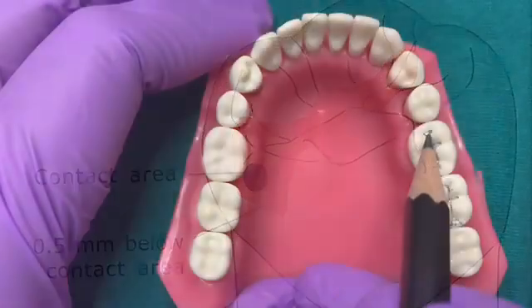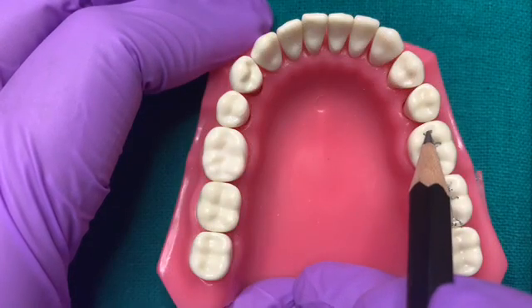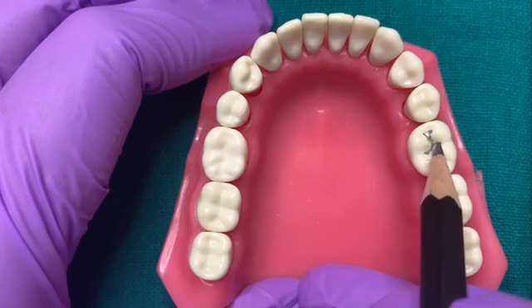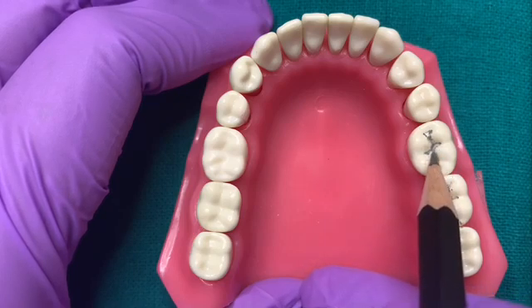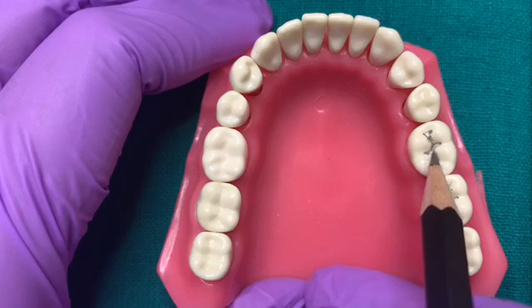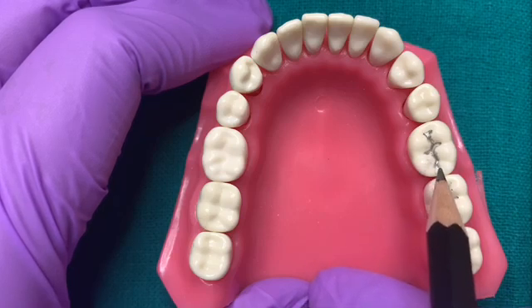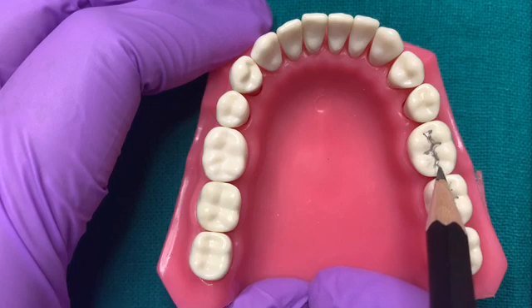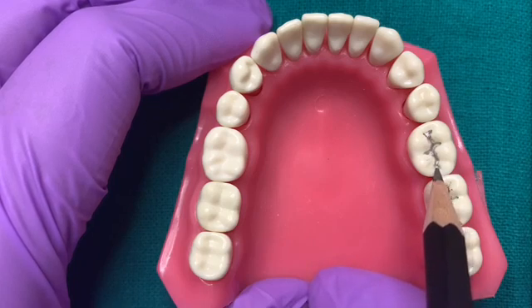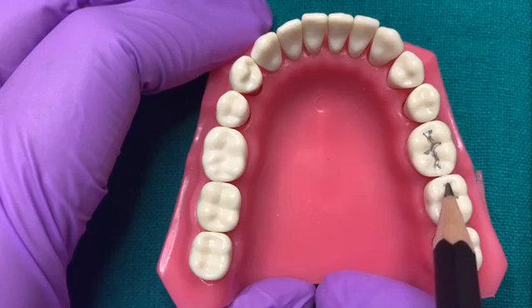We begin from the mesial groove, move along the central groove, go towards the buccal groove, then again the central groove and then towards the lingual groove. Then we follow the central groove till we reach the distal pit. Now on reaching the distal pit, since we have to proceed proximally, the first step is to mark the contact area.